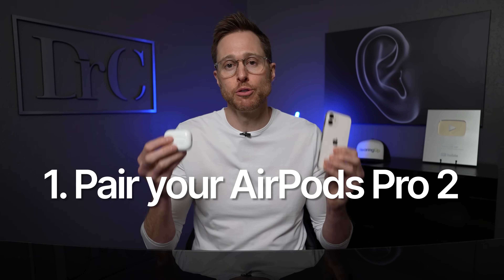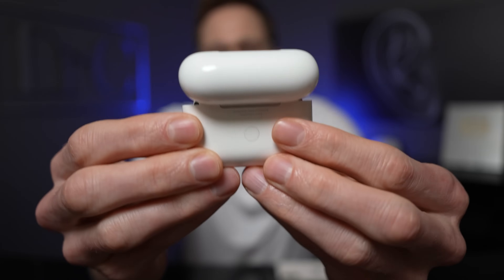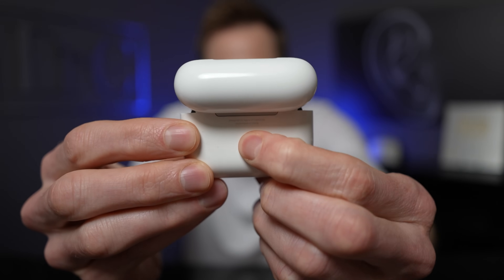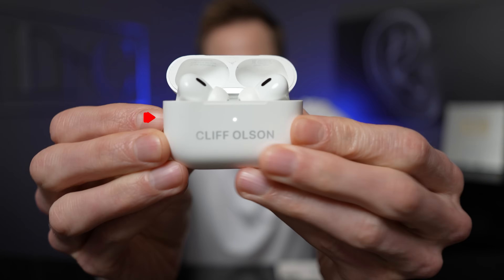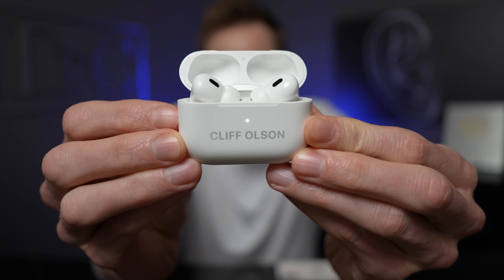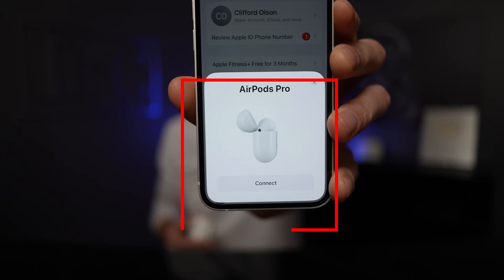The first step in this process is to actually pair your Apple AirPods Pro 2 to your iPhone if you haven't already, and this process is relatively simple. Make sure that you have your iPhone turned on, open the lid to your AirPods Pro 2, then turn the case around and find that little button on the back. Press and hold that button for a few seconds — you should see a flashing white light on the front of your charger case, putting it into pairing mode. Your iPhone should then recognize your AirPods Pro 2, at which point you want to click on connect.